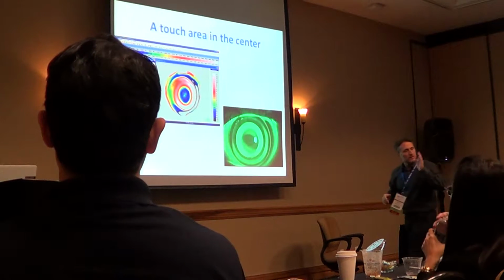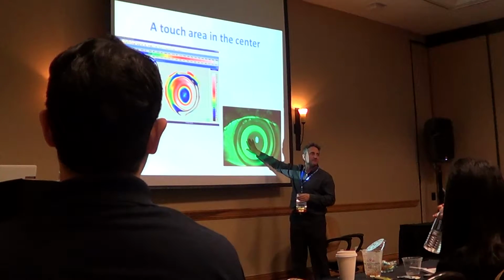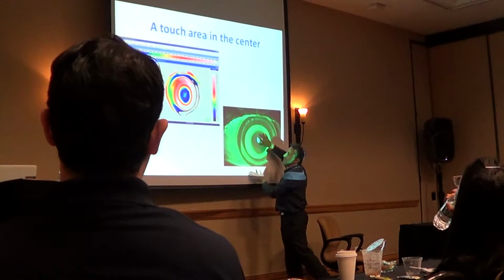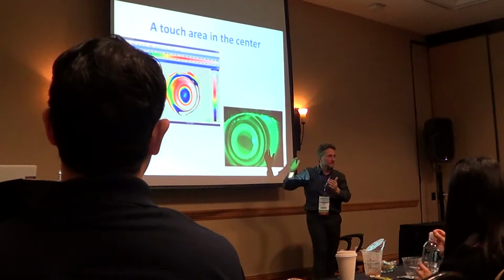Okay. Again, first, center. Second, alignment curve for nasal temporal. Alignment curve for vertical inferior. Third, total diameter. Okay. Right.